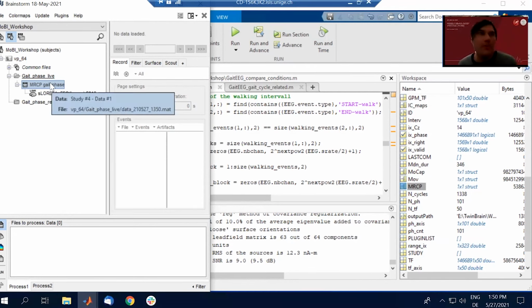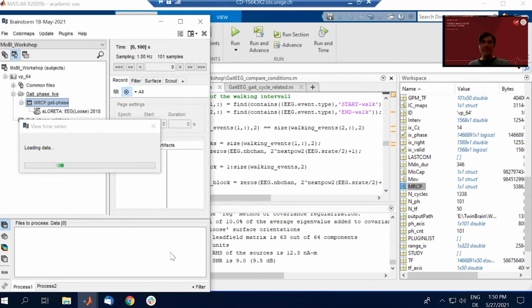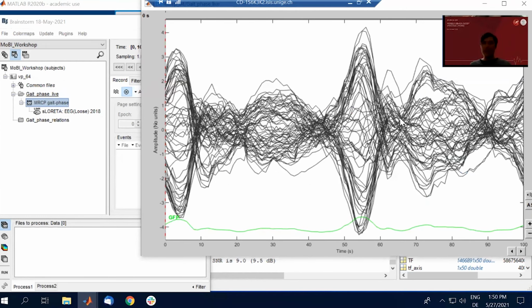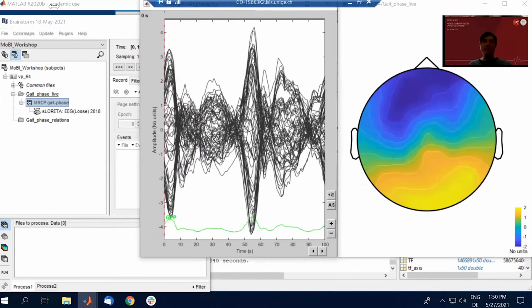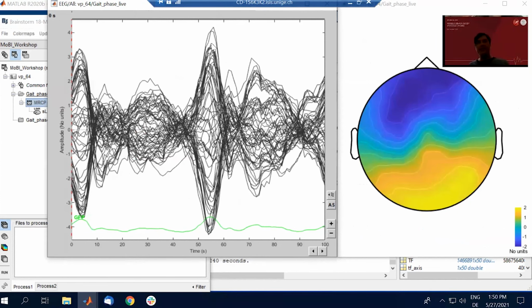It's also important to check out what's going on in the data. As I said before, this thing is not only physiological, and I think those are also artifacts. How to get an idea about that is to look at the data. What I have here is the timing and these huge fluctuations.